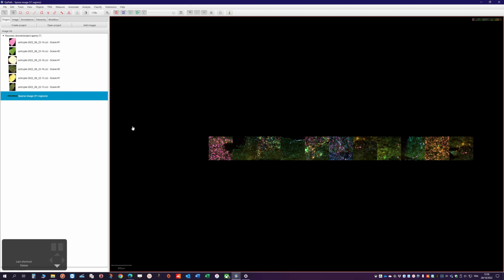So the next step to train our models is to create different images for each of the channels. I've already explained that this is typical to multiplexed analysis. When you try to create a model for a specific channel, you have to use annotations that cover those positive regions, and another class which should be background or something like this.